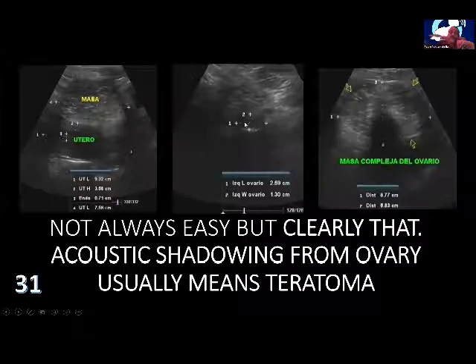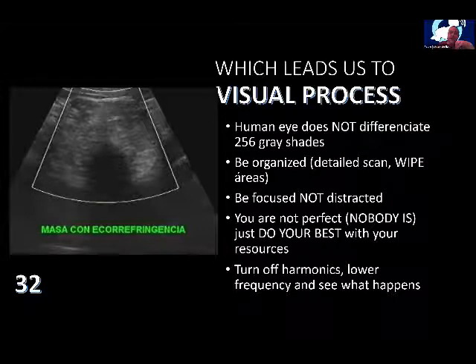This is the opposite side ovary, which is a small perfect ovary, and the mass, the uterus behind. One of the things of teratoma is that it's classically described as an anterouterine mass, which means in front of the uterus. We can find teratomas frequently in front of the uterus, between the uterus and the bladder, which here is almost empty.